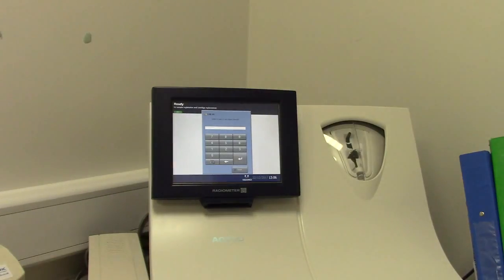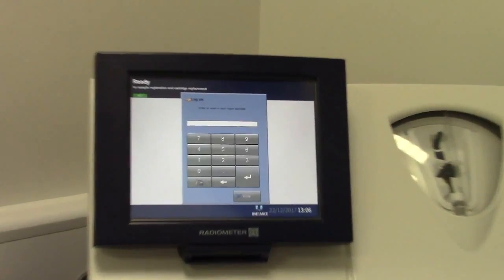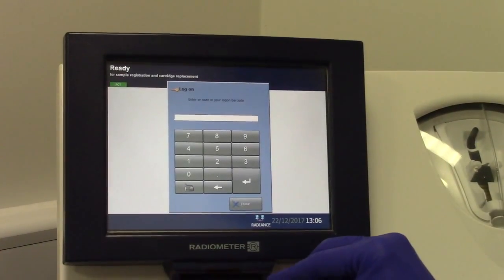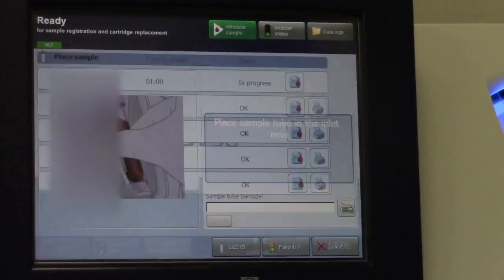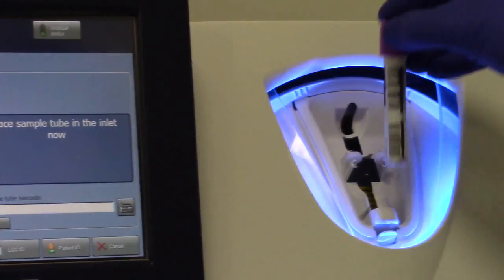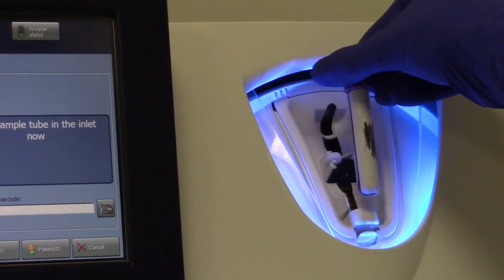Log into the analyzer using your staff ID barcode. Press Introduce Sample on the screen. Place the patient ID barcode so it faces towards the inside of the machine.